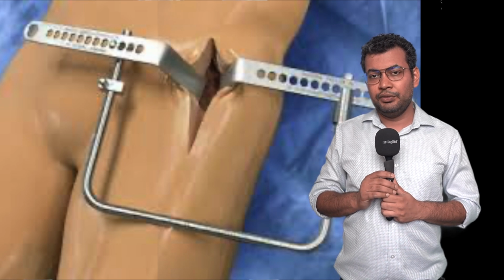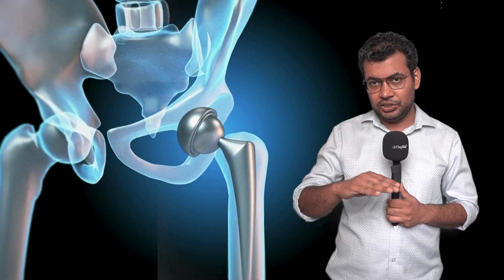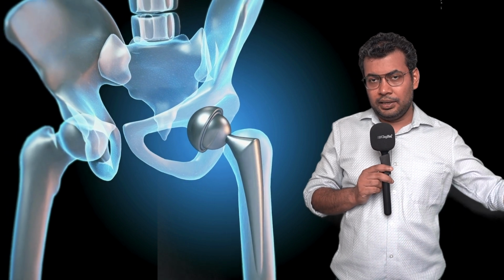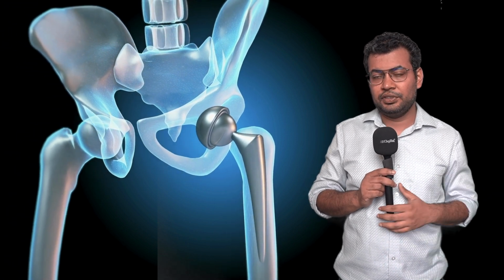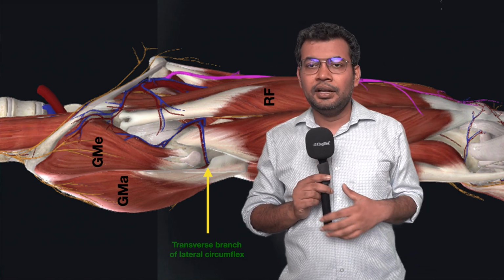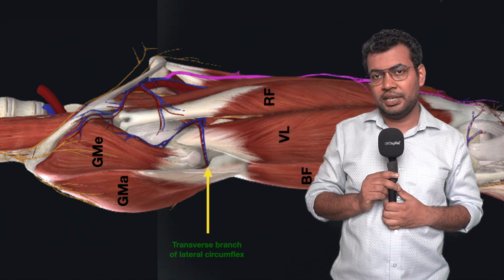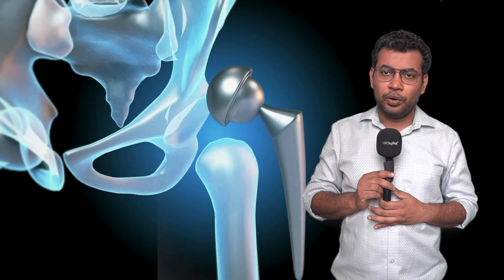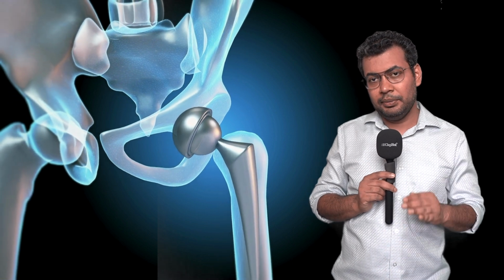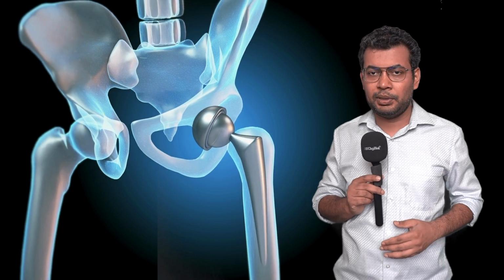Now, depending upon the involvement by the tumor, for example, if the whole bone is involved, then we will first cut the muscles from the femur. For example, the proximal attachments of the femur, gluteus medius and gluteus minimus, we may have to cut these muscles, keeping a margin of 1 centimeter from the femur, considering the oncological aspect. Or if the GT is not involved by the tumor, we may do the osteotomy of the GT, so that later on we can attach this bone to the tumor prosthesis.